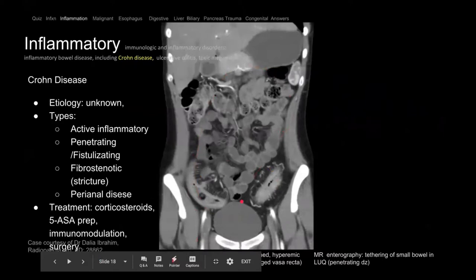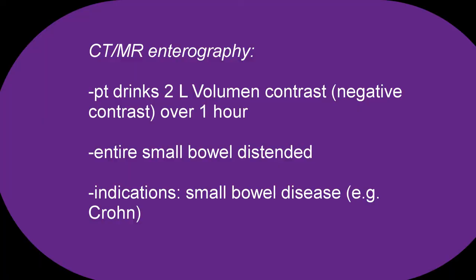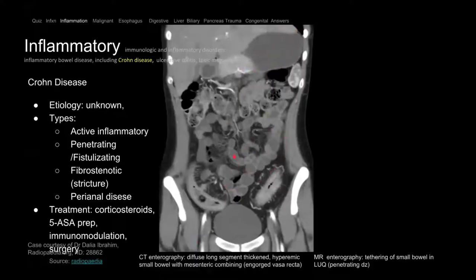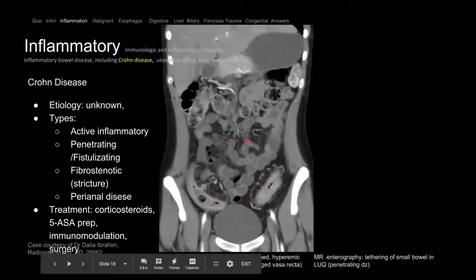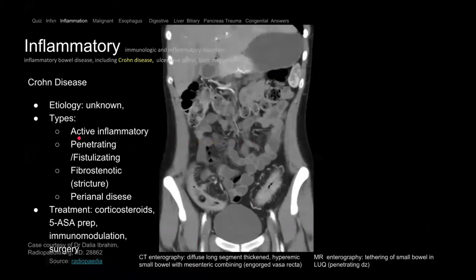This is a CT enterography — a CT of the intestines with a special study. The fluid is low density, so we call this negative contrast because it's dark, in contrast to positive contrast which is bright. Negative contrast allows us to see the bowel wall lining better. Here we see normal bowel up top, but the wall is thick with the comb sign — engorged vasa recta. The bowel wall is hyperemic, so it's acutely inflamed with engorged vasa recta, and we only see one segment. This is Crohn's — specifically the active inflammatory presentation.